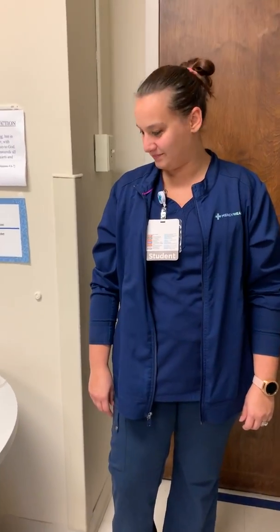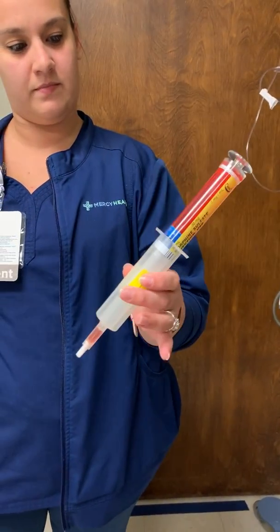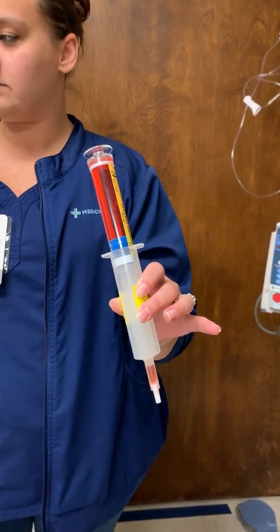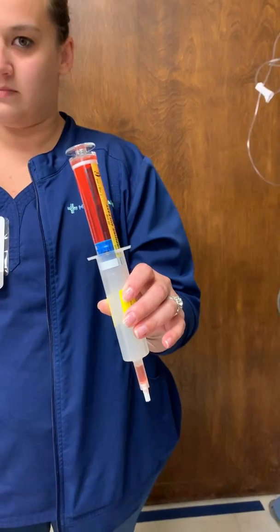So the medication syringe may come from Omnicell or from the pharmacy. And you'll see that we put some red liquid in there. Of course, the liquid is not going to be red, it will be clear, but hopefully that'll help you see a little better. But you do have to be careful when you're priming the tubing because the fluid is hard to see, and hopefully this will help you in the directions.